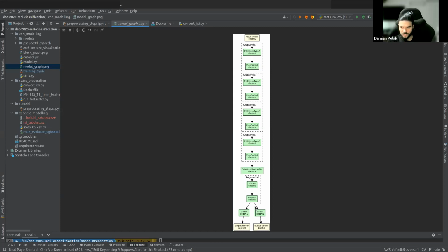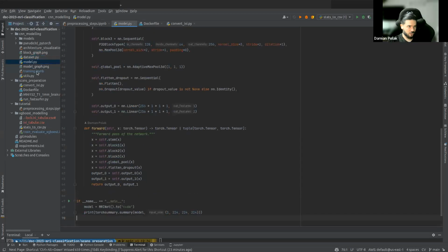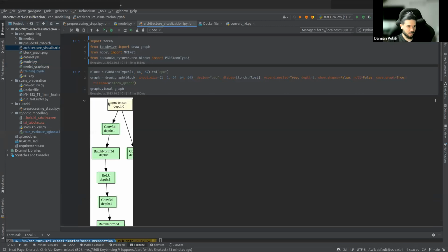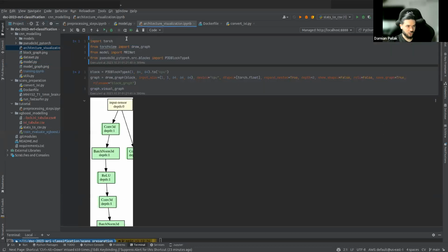If this is clear, we can proceed with training. One more thing. To visualize networks in PyTorch like that, to produce these graphs, you can use the torchview library, which is really useful for debugging and presenting the architectures of the model made in PyTorch.